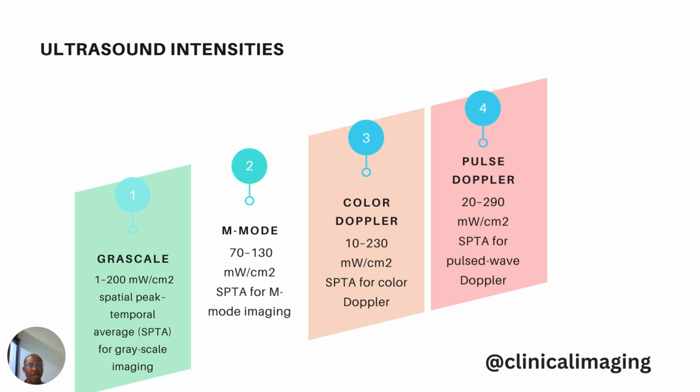So you have to be very careful with the mode of ultrasound that you are using, especially in obstetrical scan or while scanning neonates and pediatric patients. It may not matter so much with adult patients, but with these patients I mentioned, neonates, obstetrics, and pediatrics, you have to be very careful. There are a lot of ways to do this. Already, the manufacturer gives us a preset that has the MI values that are suited for these particular patients.